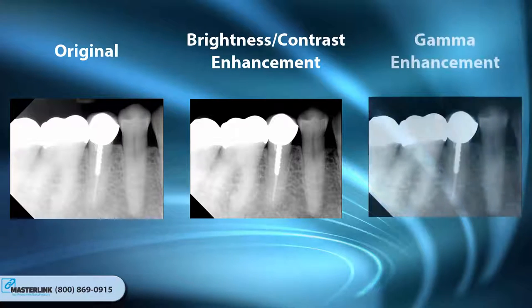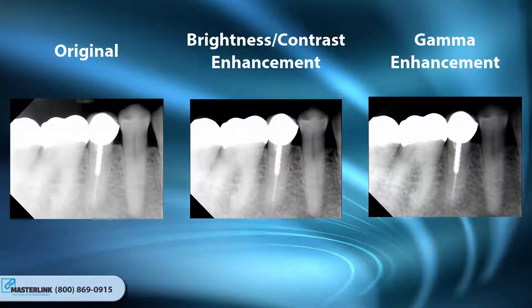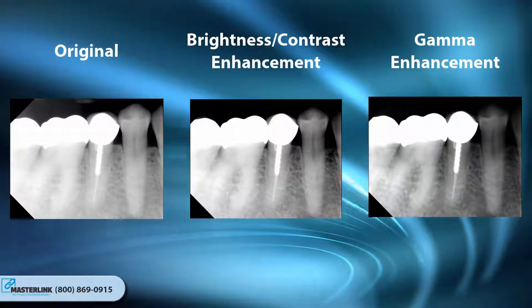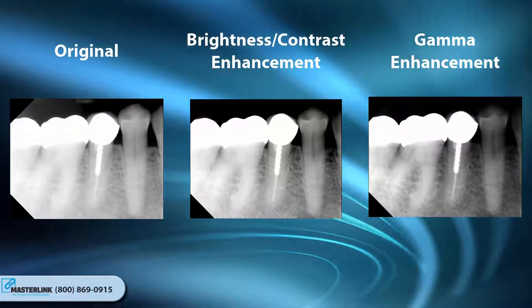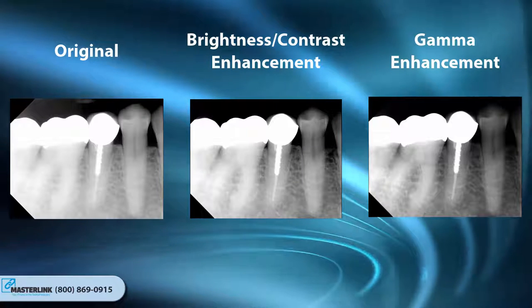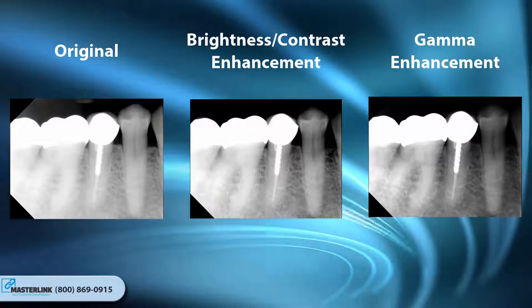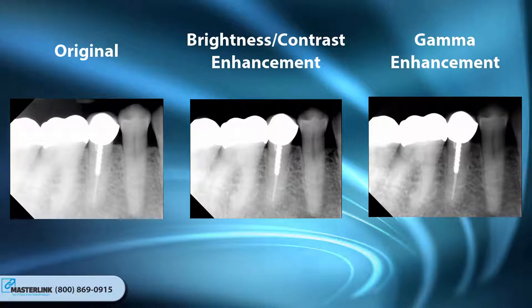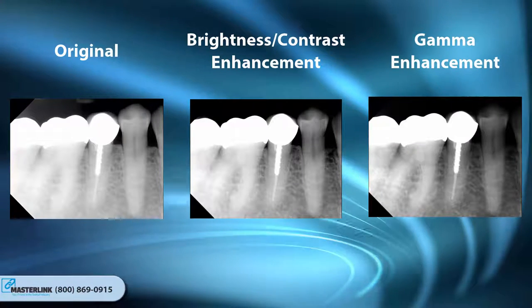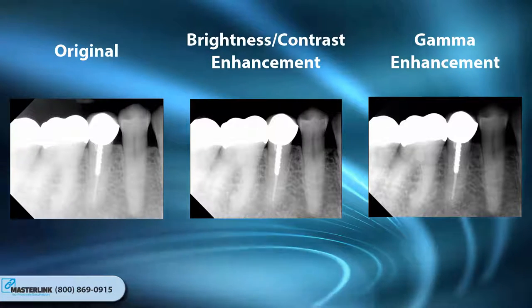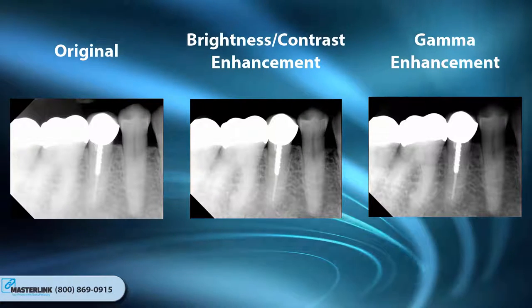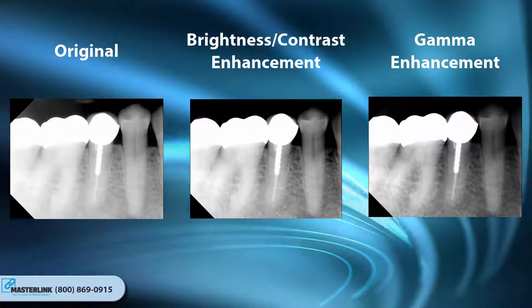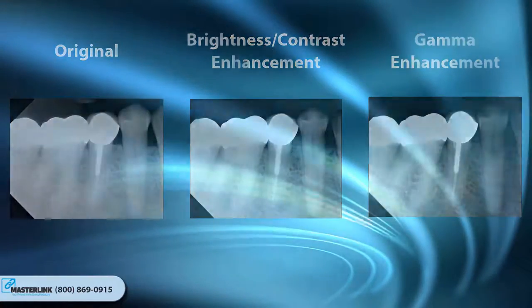Gamma Correction differs from standard brightness enhancements. It dynamically adjusts each pixel to prevent washout at the extreme light and dark ends of the spectrum. Usually, Gamma Correction is used in combination with one of the other Brightness Contrast enhancement tools to dramatically improve the overall appearance of an image.